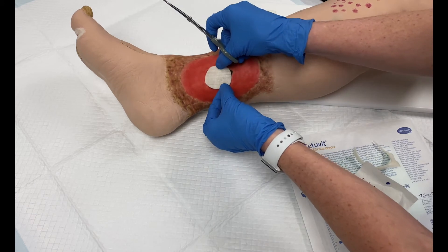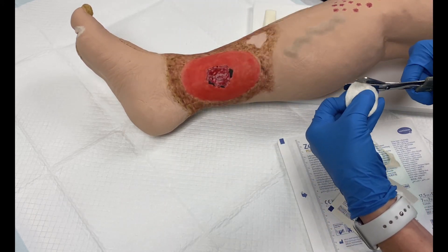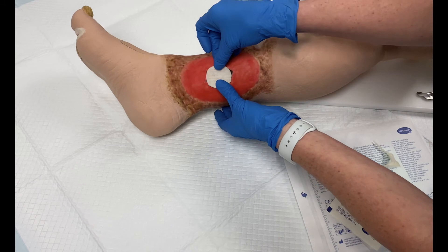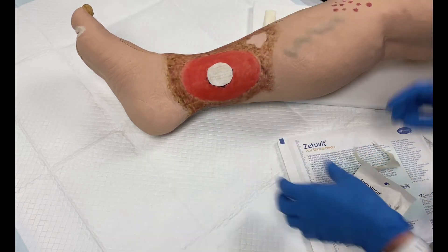Apply Sorbolgon inside the wound. The dressing should not overlap the surrounding skin. For heavily exuding wounds, apply the dressing directly to the wound bed. For drier wounds with very little exudate, moisten the wound bed with distilled water to begin the calcium alginate gelling process.